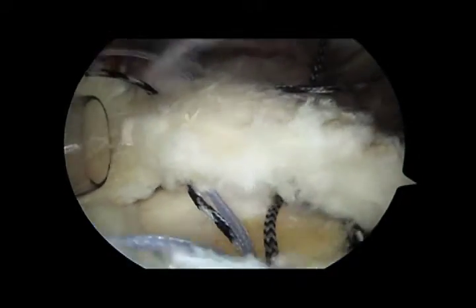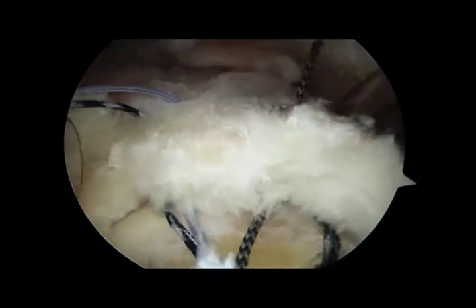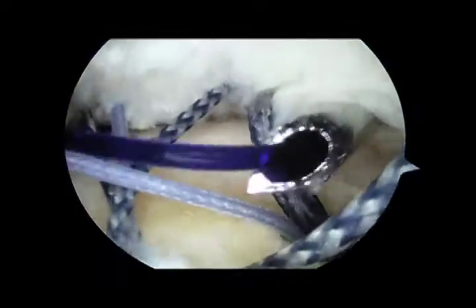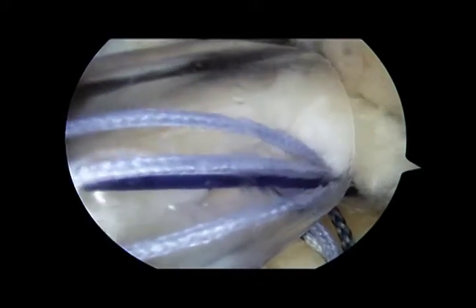This places the posterior suture in a horizontal mattress configuration. Not shown is the retrieval of the medial limb of the middle suture out the posterior cannula. A shuttling device passes another PDS, which is used to shuttle the middle suture back through and out the anterior cannula in a simple suture configuration.